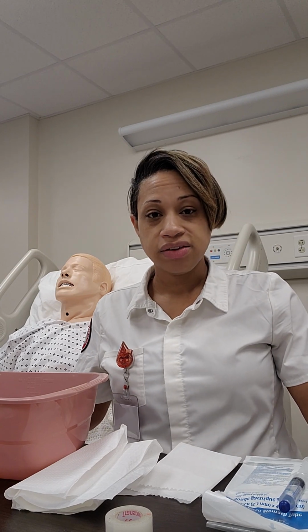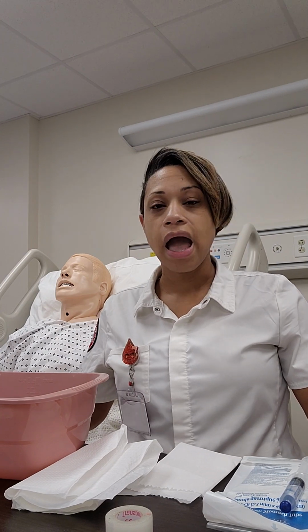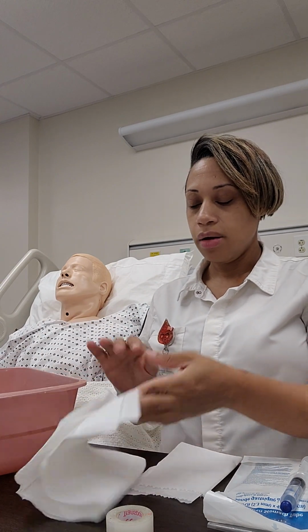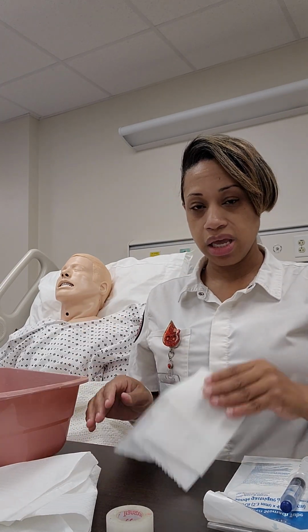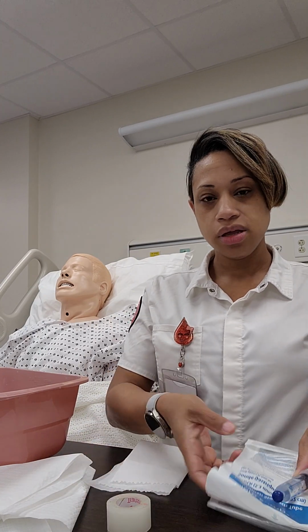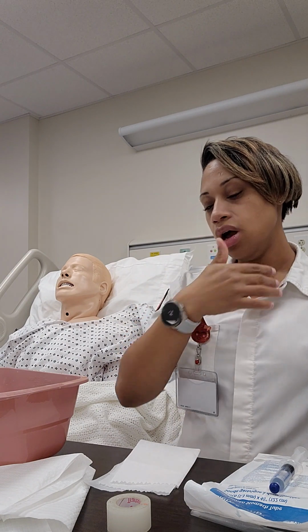Once I have identified everything for the right patient with the medical chart, I will gather my equipment, which is going to be my basin, my drape, my tissue, tape, lubricant, and the actual NG tube.